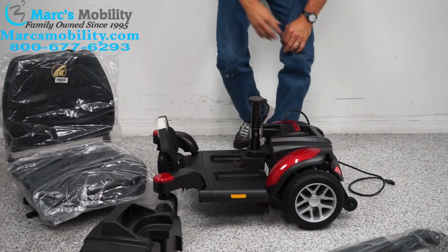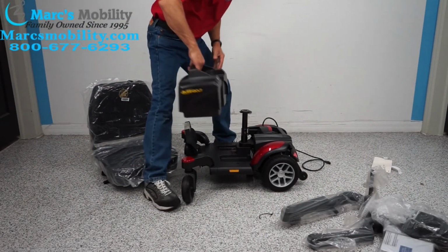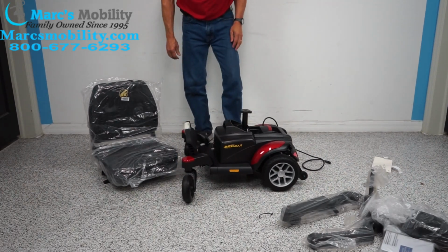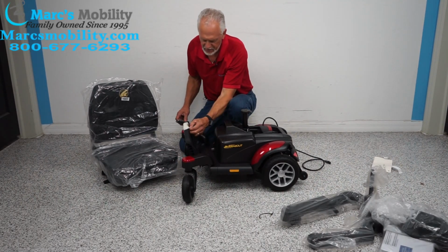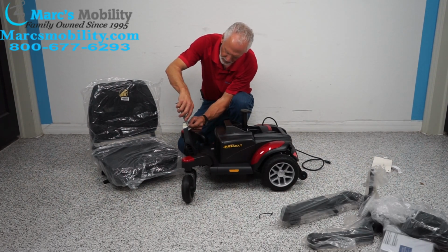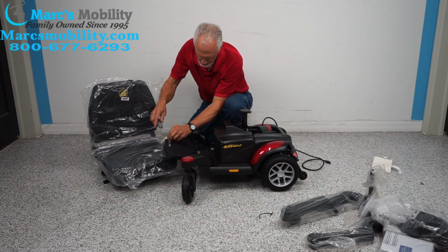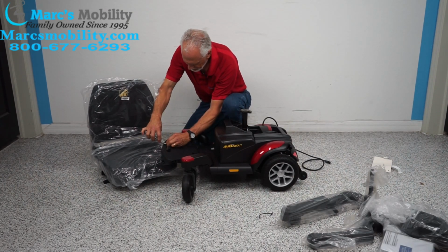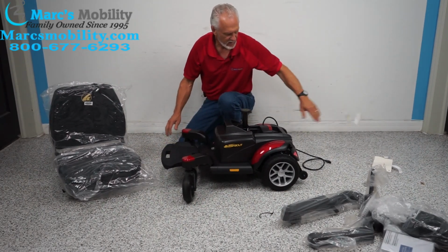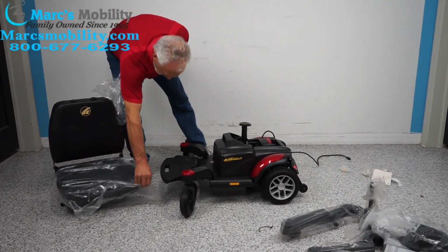So what I'm going to do now is I'm going to take the battery pack and I'm going to drop the battery pack in here. There we go. And the next thing I'm going to do, I see a little bit of tape in front here. So we're going to be really careful and pull this off without scratching this little machine. Okay. So now we've got the foot plate down. We've got this. So the next thing we would do is we would take the seat here, take the cover off the seat.